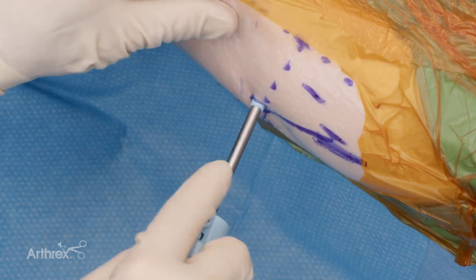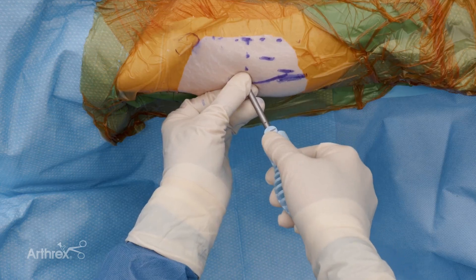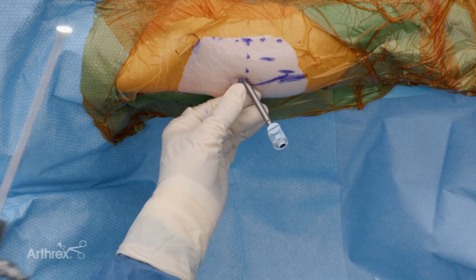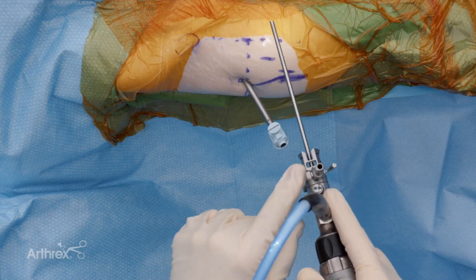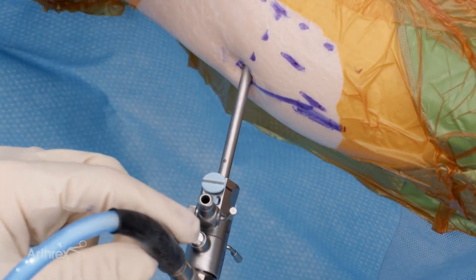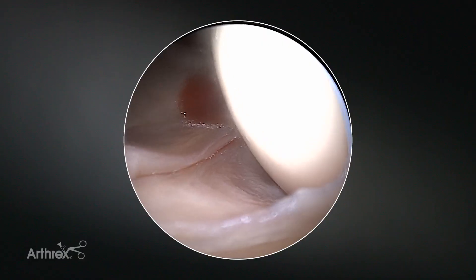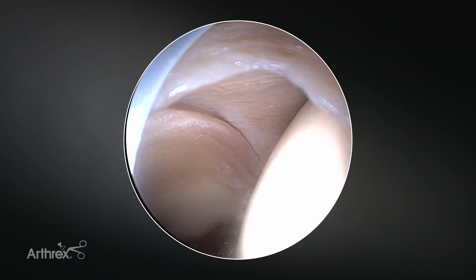As we place the cannula, we dilate, rotate, and access the hip joint. We disengage the obturator by pressing on the surgeon's hand side of the device. The camera itself also has a chin-up bar, so we align that chin-up bar with the line on the cannula to click right in. We have achieved good access and go into the arthroscopic view. Most teams, including ours, start with a dry arthroscopic surgery — no arthroscopic fluid injected before surgery. You can often see a small meniscus-type appearance of blue from the flush fit cannula at the periphery of your arthroscopic image; that will go away when arthroscopic fluid enters the field.